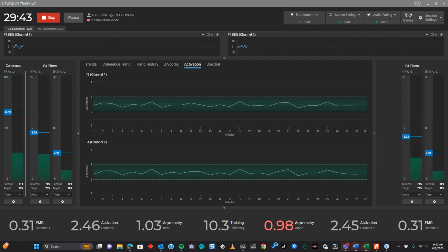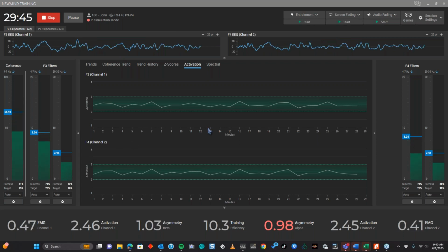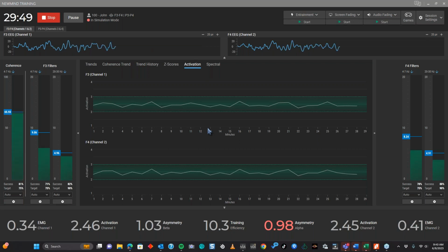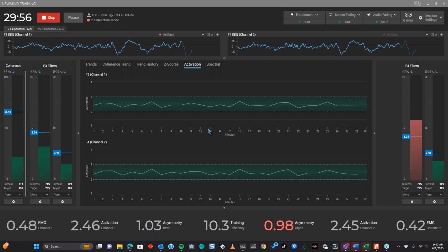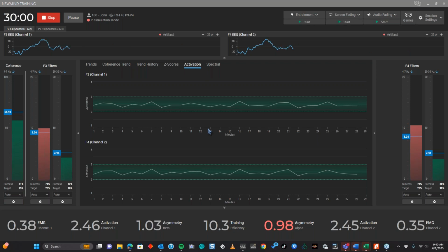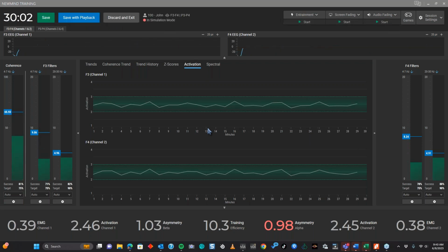But to answer that part of the question, in case she watches this later: yes, your activation numbers are going to be quite high if you're looking at the performance screen, let's say at the end of their first session, and you see that the compression line is high, where we know compression and convergence should be as low as possible on that performance screen.